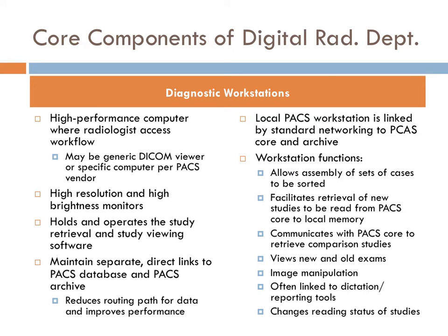Diagnostic workstations are used when PACS is implemented. Diagnostic workstations are high-performance computers where the radiologist accesses the workflow. So if you take an image and it shows up on your screen, that does not mean that it is a diagnostic workstation. The radiologist really needs the diagnostic workstation because they're making a primary interpretation from the image. The diagnostic workstations can be generic workstations that have a DICOM viewer on them, or they can be specific computers from each PACS vendor.